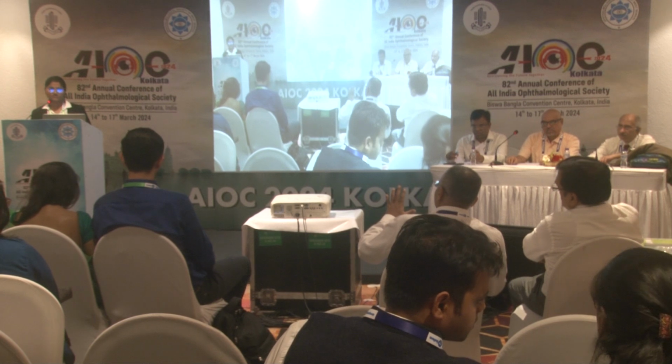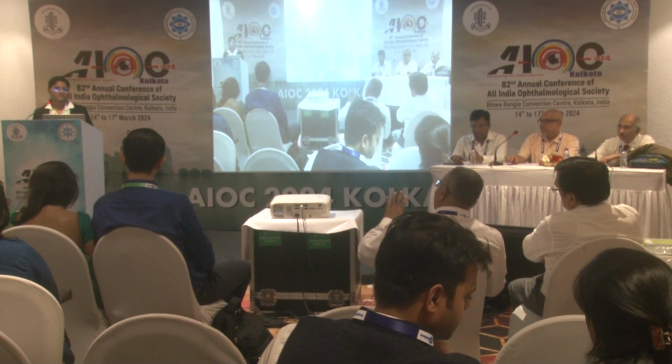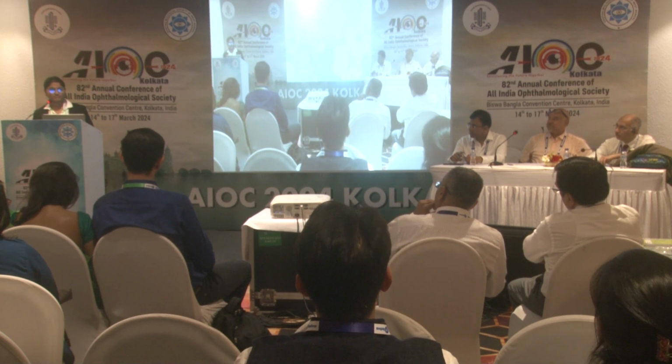So the point is that the flashlight, do you use a constant flashlight for it? Yes, sir. Then only you can see, isn't it? Yes, sir. And does that phone have an inbuilt continuous flashlight? Sir, video mode was used, and videos were captured, and the images were taken from the video.